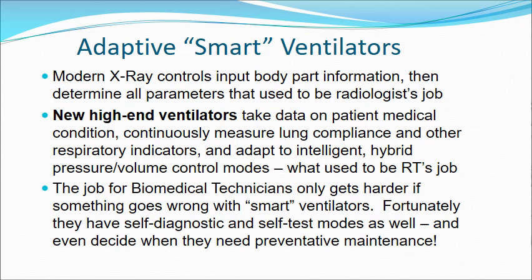So adaptive smart ventilators are the wave of the future. Modern X-ray controls input body part information, then they determine all the parameters that used to be the job of the radiologist. The new high-end ventilators take data on patient medical condition, continuously measure lung compliance and other respiratory indicators, and adapt to intelligent hybrid pressure volume control modes, what used to be the RT's job.